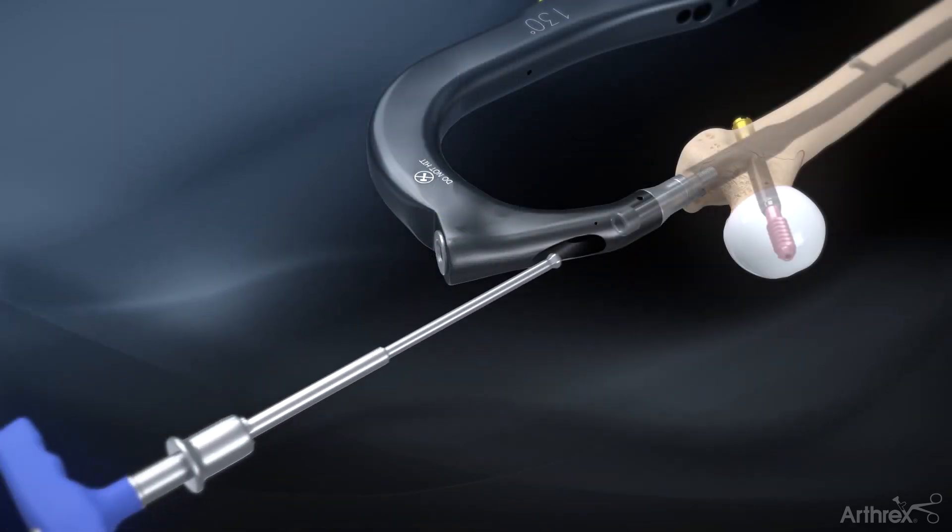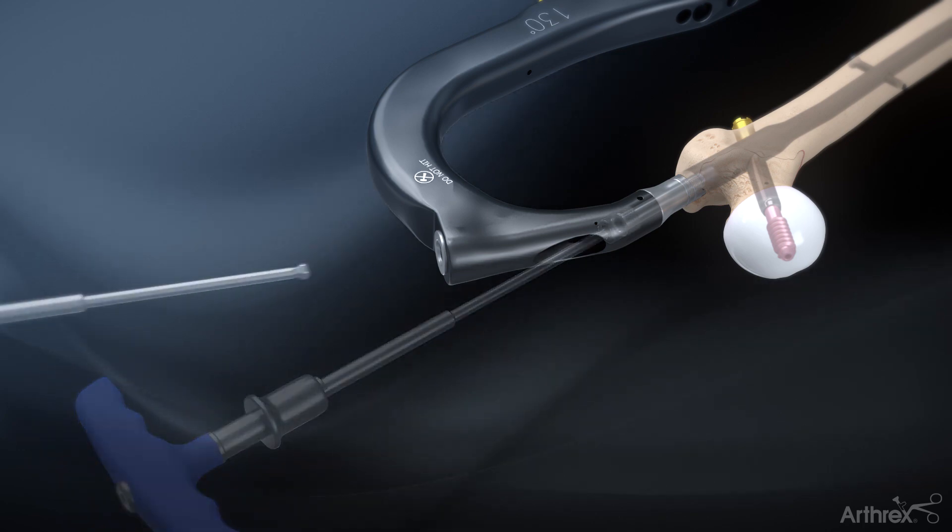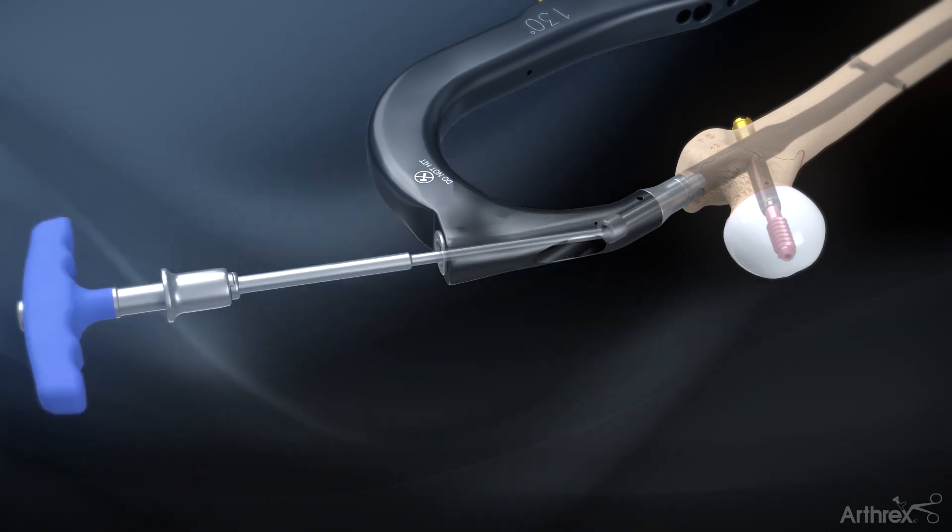To remove the targeting arm, unscrew the locking bolt from the jig through either the top hole or impactor pad attachment hole.